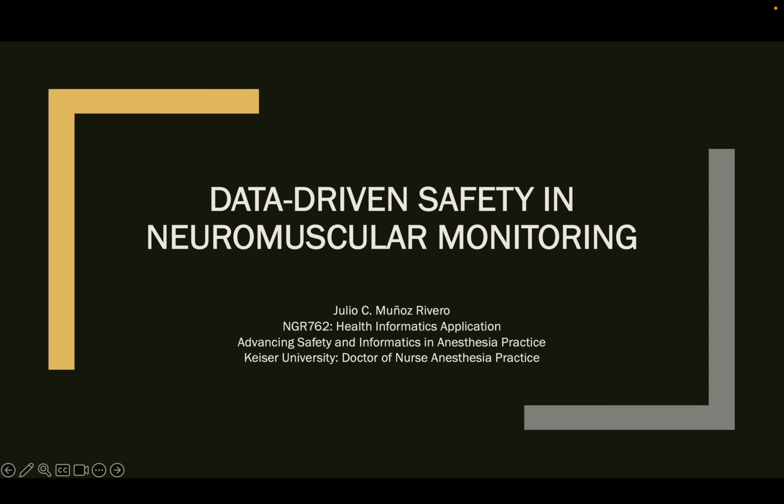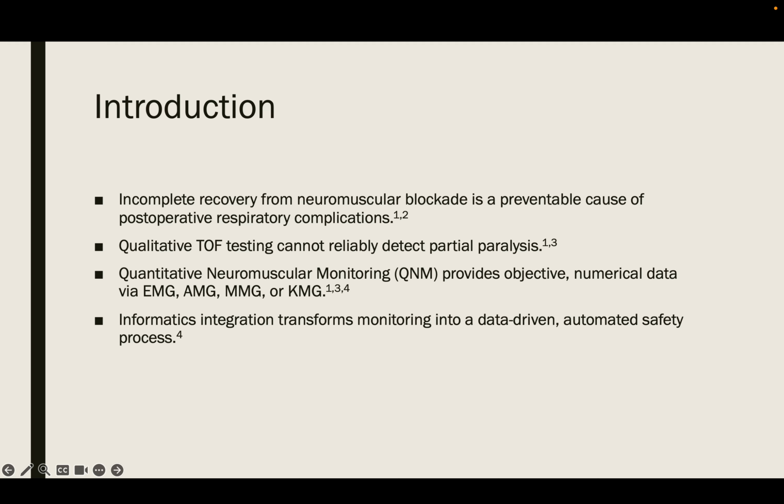Data-driven safety in neuromuscular monitoring. Residual neuromuscular blockade remains a leading yet preventable cause of postoperative respiratory complications. Traditional qualitative train of 4 testing relies on visual or tactile evaluation, which becomes unreliable once partial paralysis develops.